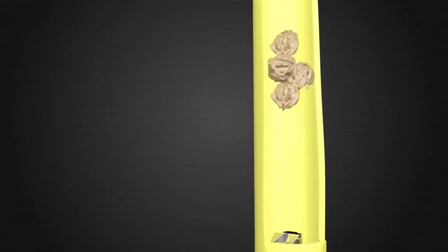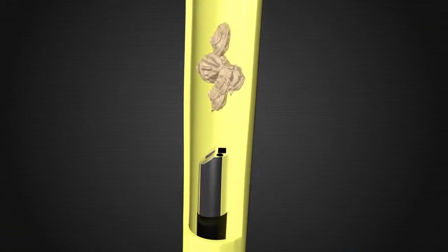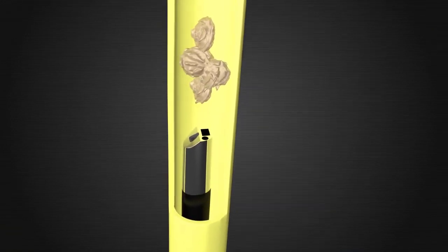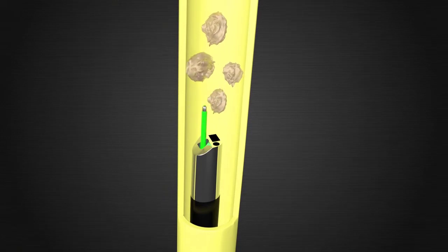We will then place our ureteroscope into the sheath and up to the level of the kidney stone. We have a camera on our scope that lets us watch what we are doing in real time. Once we find the stone, we will use a laser to either break it into several smaller pieces, a technique known as fragmentation, or to turn it into a fine sand, a technique known as dusting.